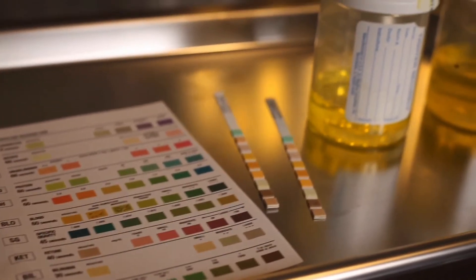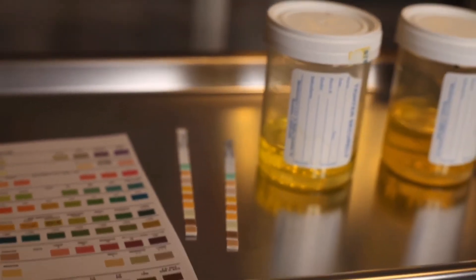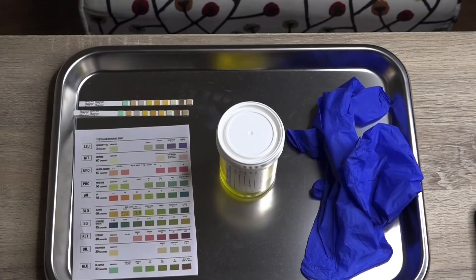So you want to of course perform hand hygiene, don some gloves. You would need the specimen provided from the pregnant woman, you will also need a test strip, and you would need the diagram because you would be referencing these test strips with the colors.